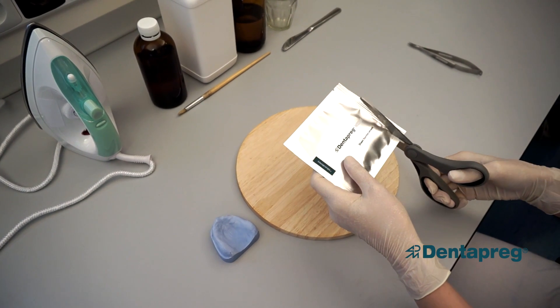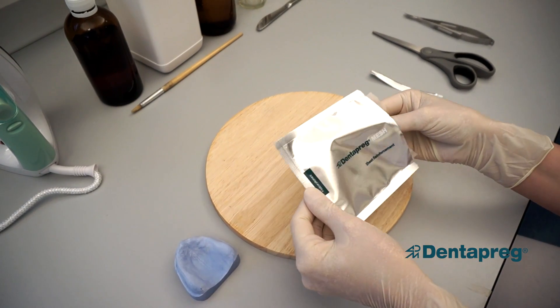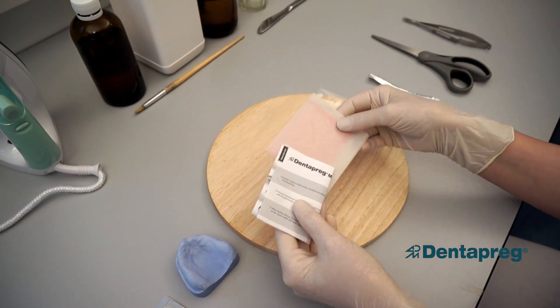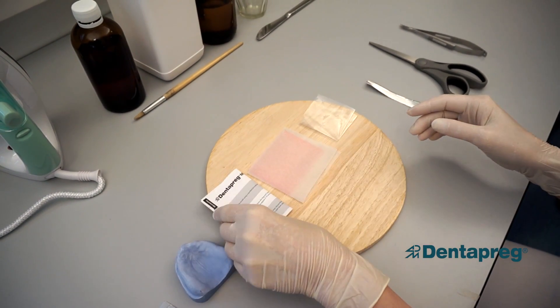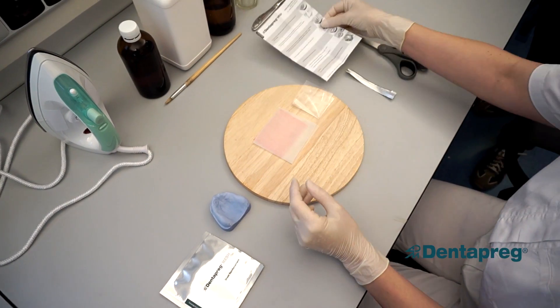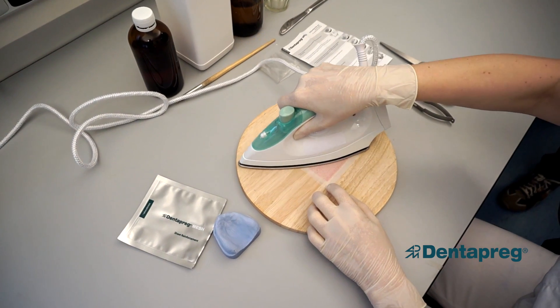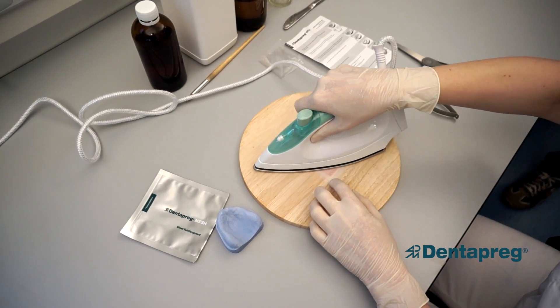Start by removing Dentepreg Mesh from the bag. Cover the mesh with the provided siliconized paper. Iron it for approximately five to ten seconds. The mesh will become pliable.